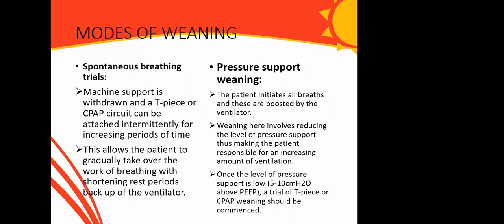We have different types; especially the modern ventilator has different weaning modes. But normally we do what we call spontaneous breathing trials. And before you commence spontaneous breathing trials, there's what we call sedation vacation. Here in ICU, we always do sedation vacation around 4 to 5 a.m. so that when I come around 8, you will be able to do your spontaneous breathing trial.